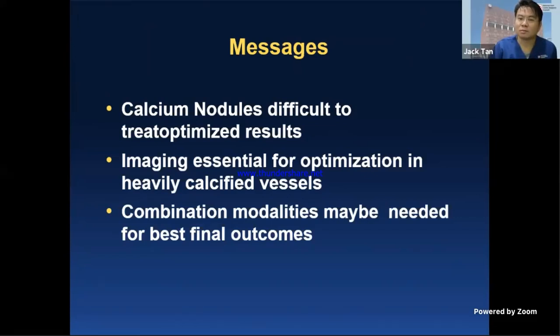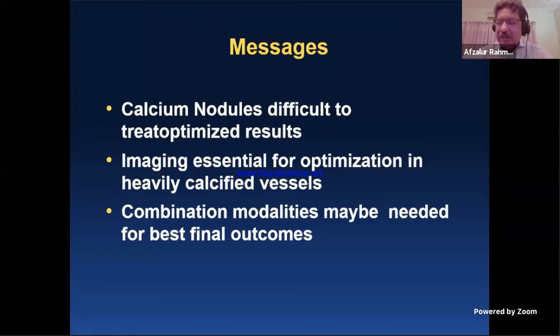Two cases. One is Tagosh. Another case is Dr. Osho. That is a fantastic case. My thought on the Tagosh case is that he rotablated and put the burr at the darker portion of the wire, and the darker portion is the softer. Is there any chance of damage to the wire or entrapment of the wire?